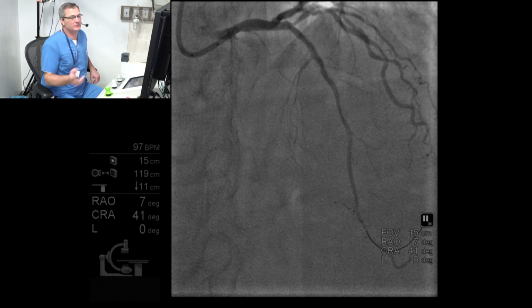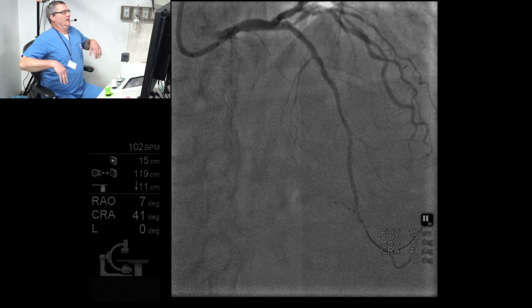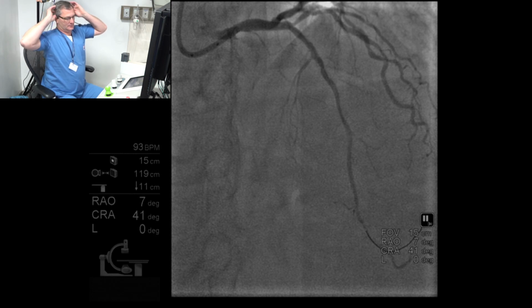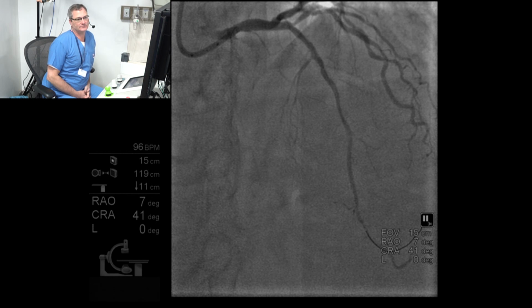Okay, we'll use it. Put it in, we can try, and then we'll remove it. I thought I heard 28. I'm sorry. No, this is another 28, is available, right? And this is 34. But there is a good chance this stent can traverse, yeah.